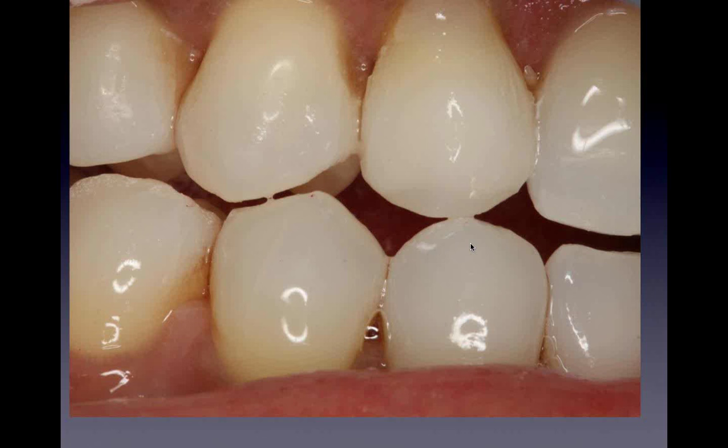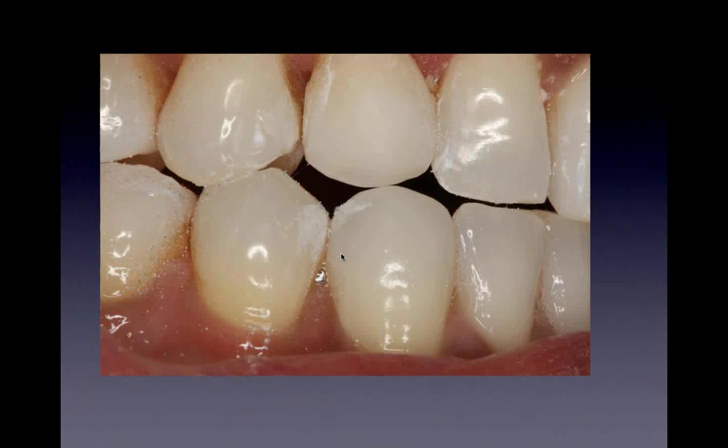And then I ask her to go into guidance. When she goes into right working, she starts hitting the edge. Again, we can't have that. I start adjusting this and I'm adjusting the upper. I'm adjusting both of them to get her into the original guidance that she had, which was here. The original guidance was premolar to premolar. So I'm going to keep doing that and try to get her back to this guidance right here. I don't want any touching here at all.